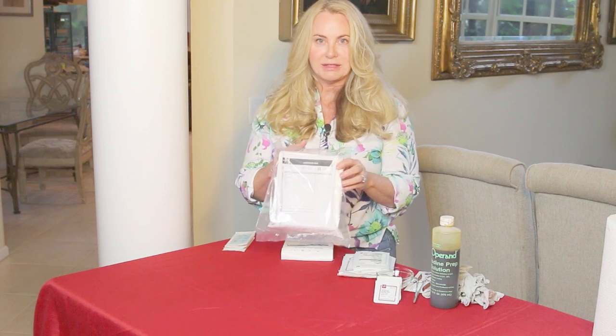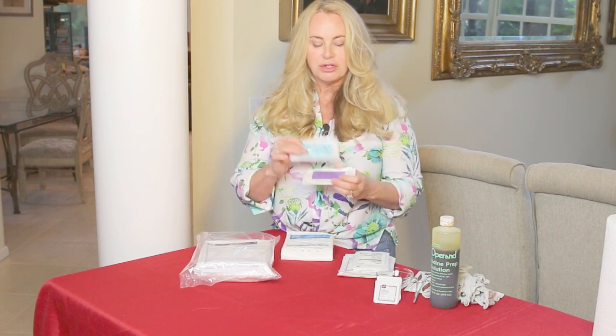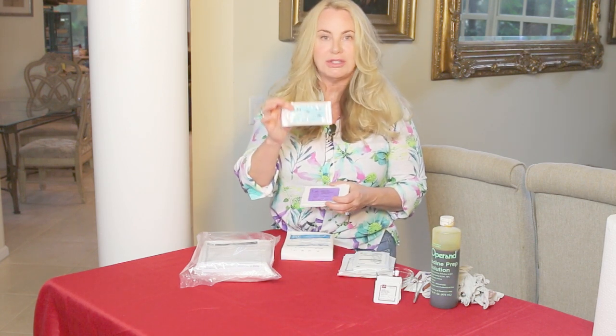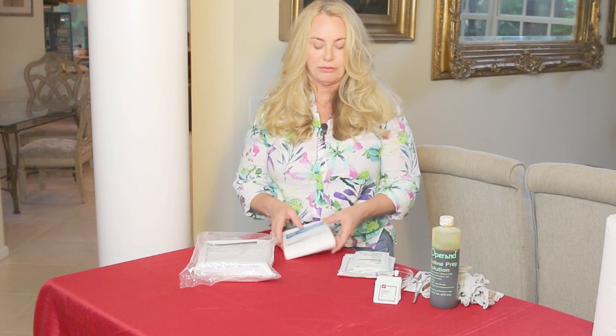Hi, Amy Alton here, also known as Nurse Amy, and I'm here to show you today how to open up a sterile field using a laceration tray. I want to show you the pre-suturing stuff, so it takes a few minutes to get set up before you just immediately start in with suturing. You want to make sure you have all your equipment — of course you're going to need a laceration tray or your instruments that you've sterilized to the best of your ability off-grid. You also want to make sure that you have some suturing material. These are usually single-packaged and they are sterile inside, and I'll show you how to get that on the sterile field without contaminating it.